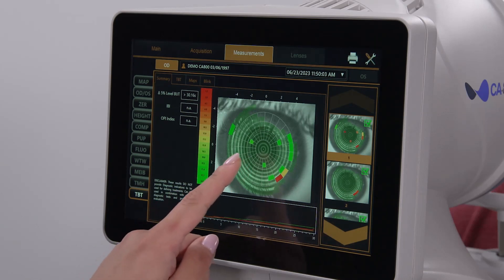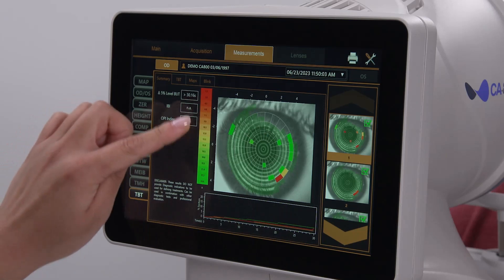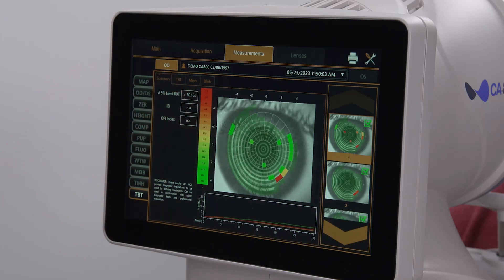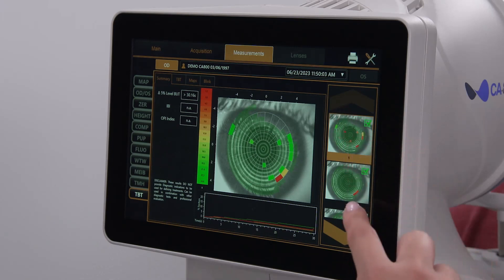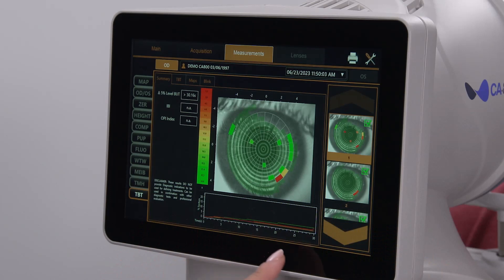In the center, the cornea is divided into sectors, with color coding to indicate the time after the blink to tear breakup in seconds. Hotter colors indicate a shorter average breakup time. In the case of the Summary Map, the average breakup time for each sector is shown based on all selected acquisitions. You can select which acquisitions to include by checking the boxes on the right side. The graph below the sector map plots the percentage of sectors where the tear film has broken over time.